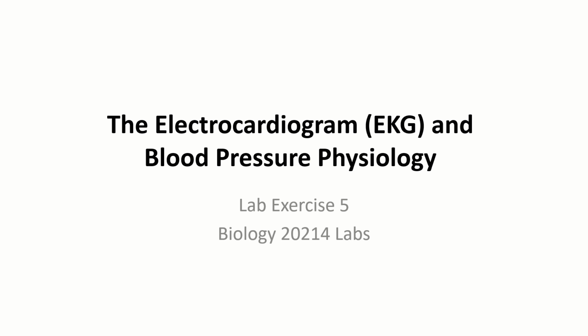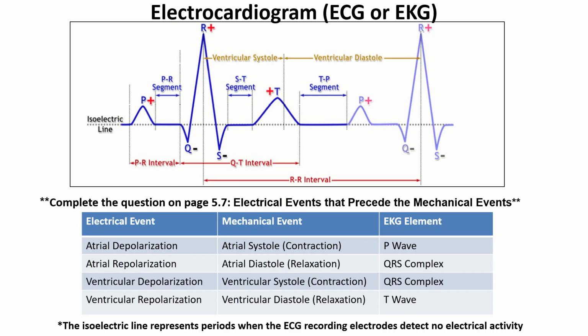Hello students. In this video, we're going to be discussing what you need to know prior to your EKG and blood pressure physiology labs. To begin with, it's important to note that the labs will be carrying out two separate exercises simultaneously. Half of the groups will be working on EKG data, while half of the groups will be working on blood pressure data. Even though you may be working on different experiments, you are all responsible for all discussion questions and all elements of the lab exercise.